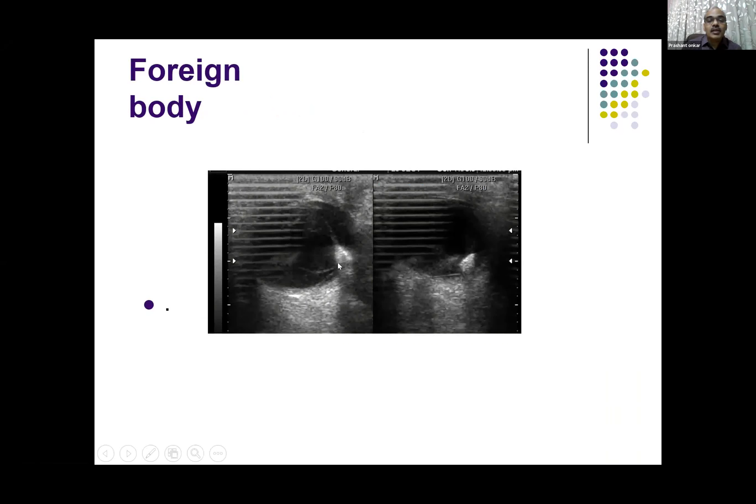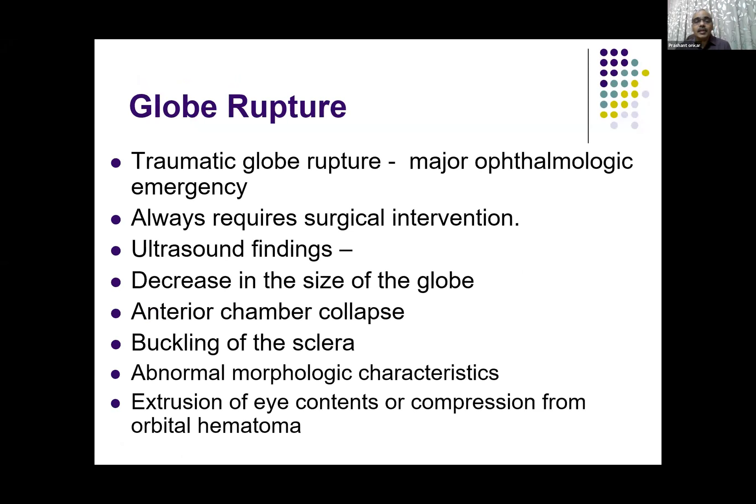This is another foreign body — again seen as a very hyperechoic or very bright structure giving some posterior acoustic shadowing. You can see some membranes in the posterior vitreous. Due to the foreign body usually being inserted very rapidly into the eyeball, it definitely produces damage to the eye.